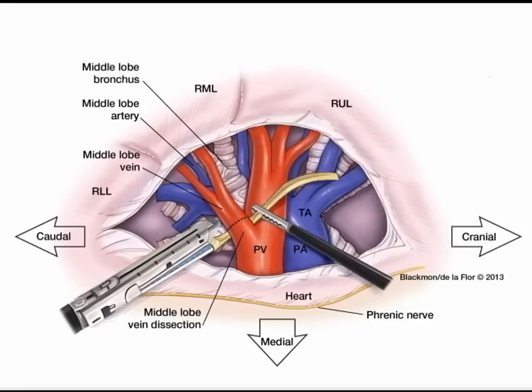Once you've dissected the superior pulmonary vein, make sure that you are only encircling, stapling, and dividing the right middle lobe branches of the pulmonary vein, specifically preserving those branches going to the right upper lobe. Once this structure has been encircled, you may pass the passer behind the pulmonary vein branches to the right middle lobe, or simply pass the stapler around those venous branches and divide the vein.